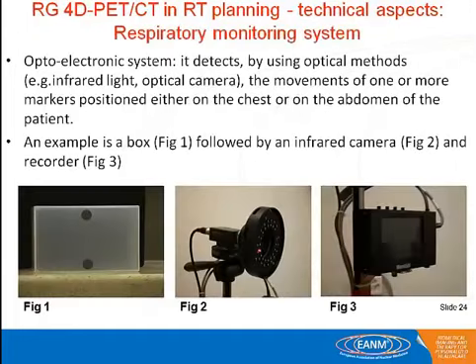We changed it by having a new tomograph. We tried to adapt a new system, the opto-electronic system, the same one that our radiation therapy department used. So we have an optical camera with a simple box, and the camera looks at the movement of the box.